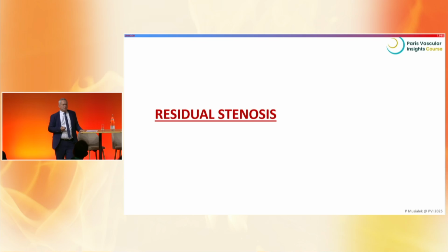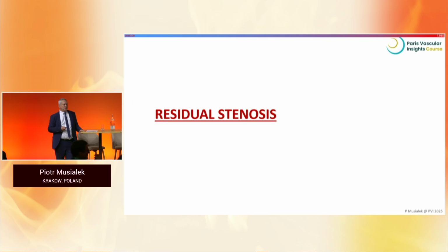We've all seen examples of bad cases when the lesion was not prepared and the stent showed significant in-stent restenosis or malapposition. Residual stenosis. Who's bothered by residual stenosis? Anyone? Paolo, you don't like residual stenosis. I don't like it. Why? Isabel, why don't you like residual stenosis?